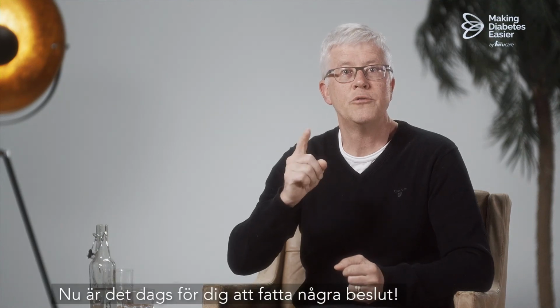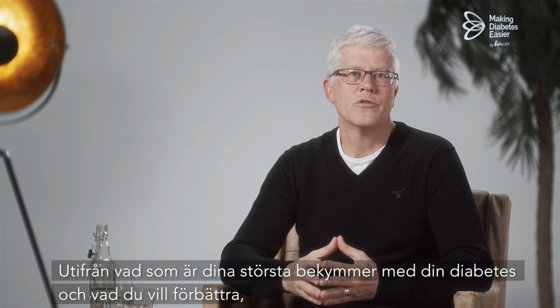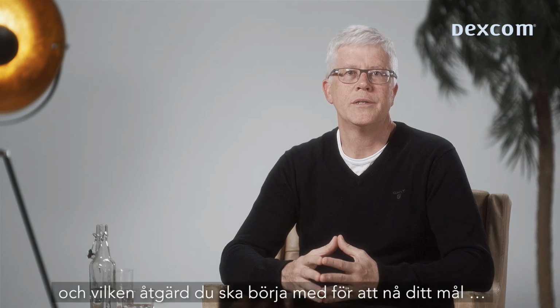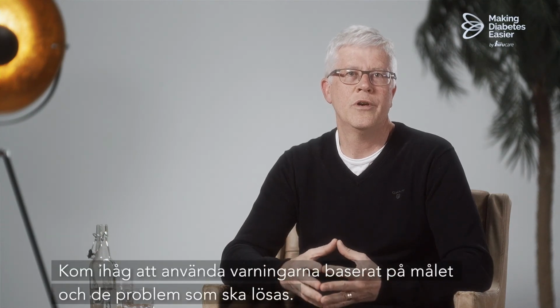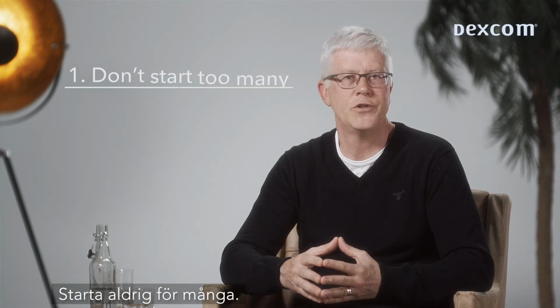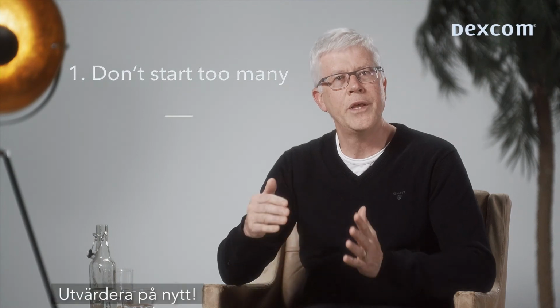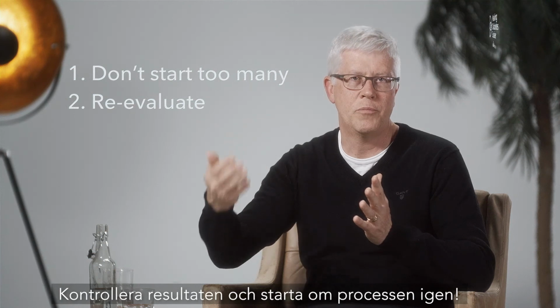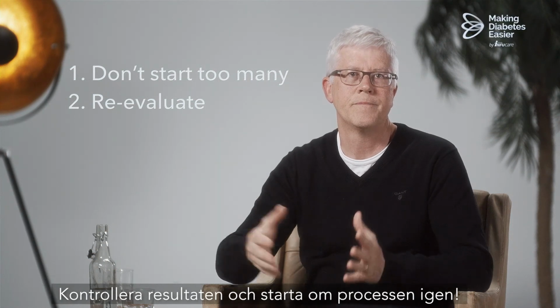Now it's time for you to take some decisions. Based on what your greatest concerns are with your diabetes and what you want to do better, and what action to start with to reach your goal. Choose your alerts. Remember to use the alerts based on the target and the problems to solve. Never start too many. And then re-evaluate. Check your outcomes and start the process all over again.